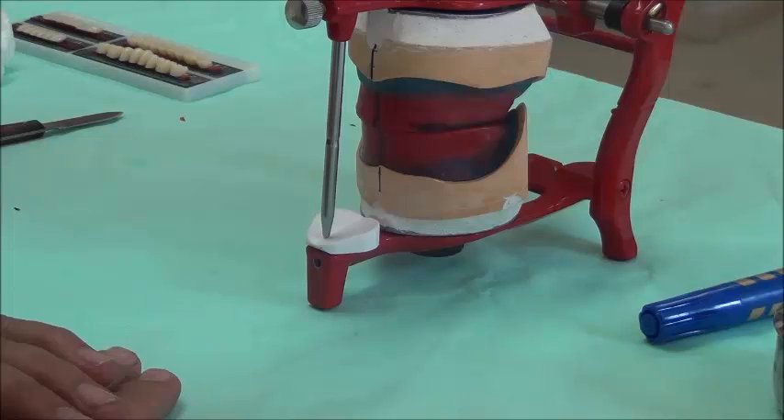As-salamu alaykum. Today we will be talking about the setting of upper and lower teeth using acrylic teeth for our case.